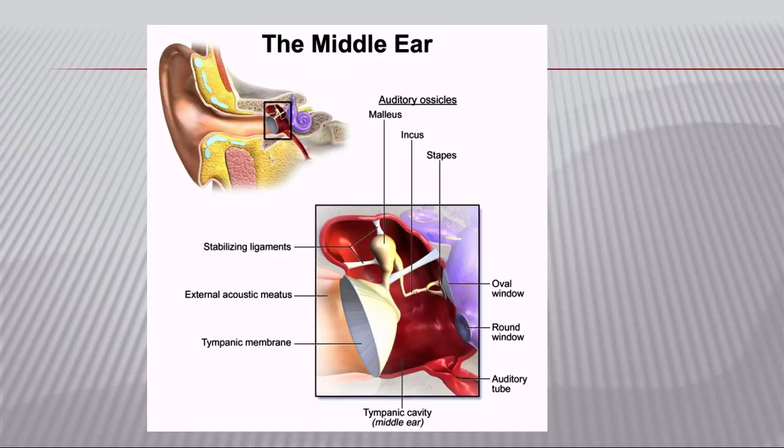It essentially pulls the stapes slightly out of alignment, and it's going to cause what is essentially stiffening of the ossicular chain. And that we can't measure. But when the ossicular chain becomes stiffer, the tympanic membrane becomes stiffer and less compliant, and that we can measure. So we measure the reflex, but we measure it indirectly. We're measuring the reflex through a change in compliance of the eardrum. And it's important to remember that it is an indirect measurement, that we're measuring the reflex, but we're actually not measuring it directly.